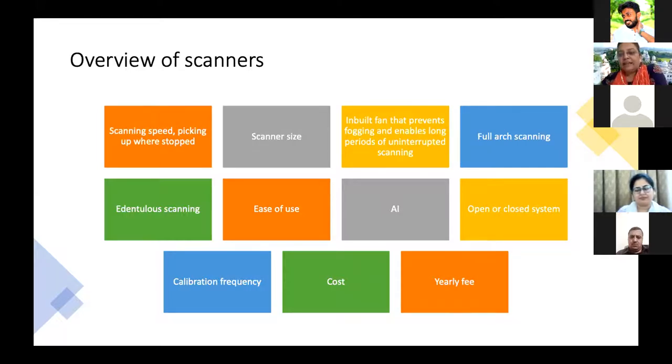But scanning teeth, scanning the alveolus, it's easy. So these are the points which are to be considered before making use.